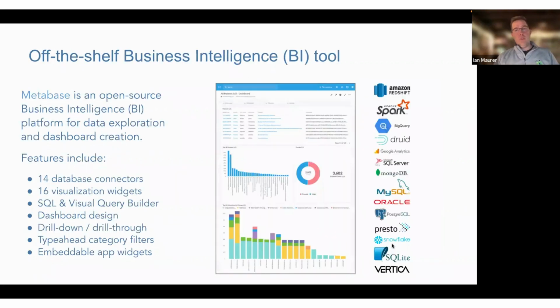And so using that API with annotate, the expansion capabilities of the biomarker bridge, and match, I put together a simple demo using Metabase. Metabase is a great open source tool, lots of database connectors that you can see over here, including Postgres and some of the different cloud providers. Lots of different widget types, and basically use the tool to build your visualizations and then tie them together into a dashboard. And those dashboards allow for drill down, which is narrowing down the values, and then drill through, which is going from one screen to the other.